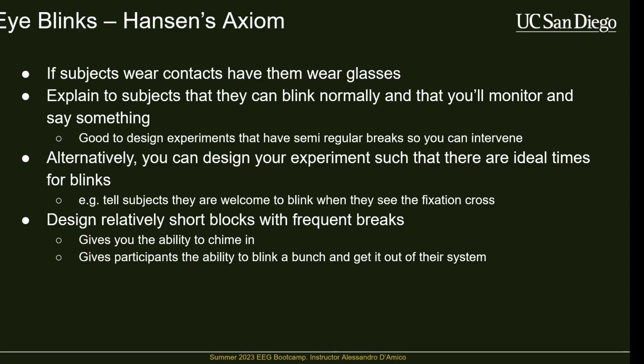But yeah, if you're considering being capped or you're open to it, please shower, because it's actually easier. Although you'll have to shower afterwards, it's easier to gel a clean scalp than a dirty scalp. So don't go surfing right before the class if you want to be capped. Salt water will almost certainly interfere with the conductivity.